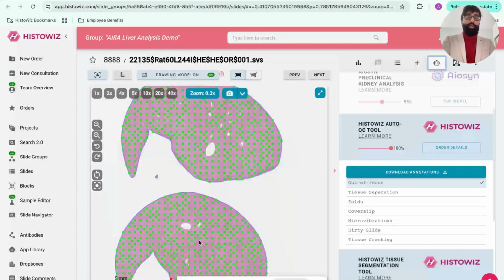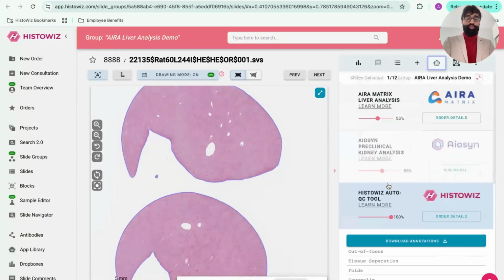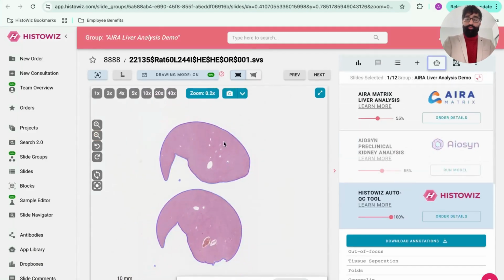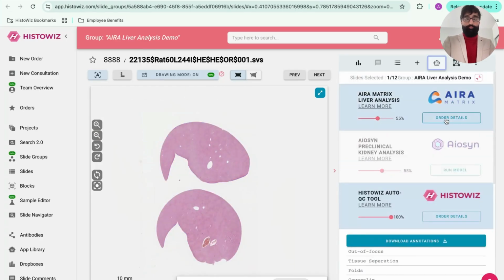And coming back, as I mentioned previously, we have also integrated third-party AI companies like AIRA Matrix. And the way in which the AIRA Matrix AI tool works is that basically you can click on Run Model over here. This is changed to Order Details for the purpose of demonstration because we have already run the AI model for these slides.